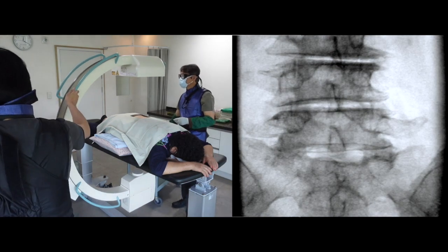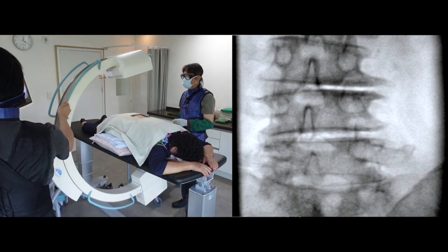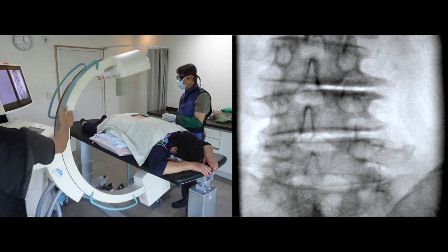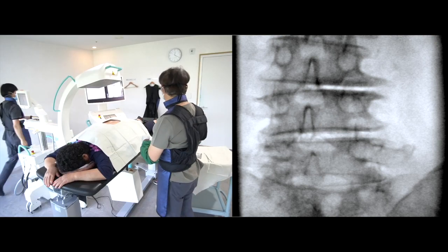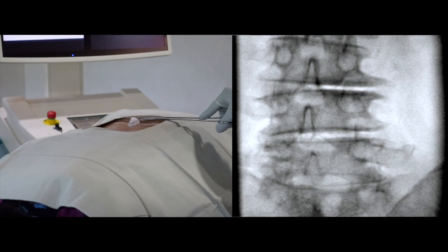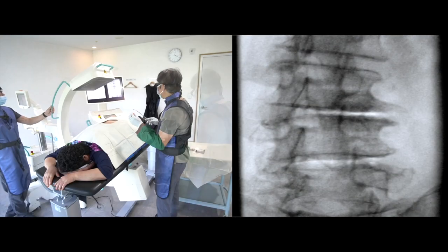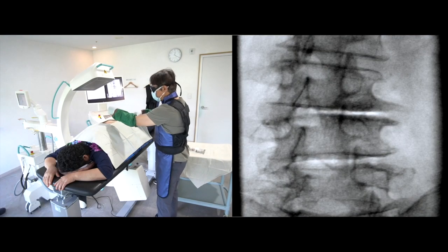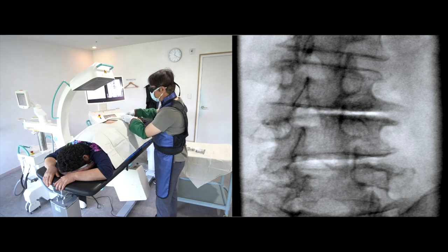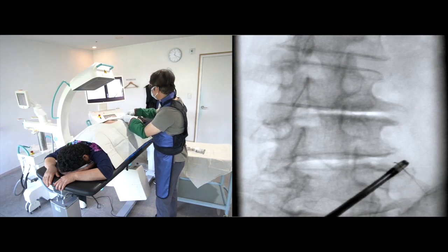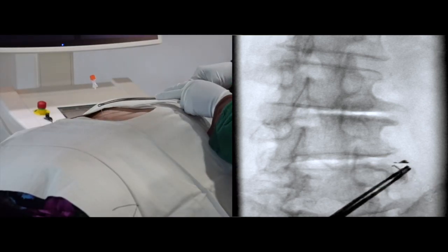I will start from the C-arm AP view. Let me turn the C-arm to the right ipsilateral oblique view. Let me clean the surgical site once more. Before facet joint injection, I'll administer steroids into the L4 infraneural space. I will introduce the needle very carefully.